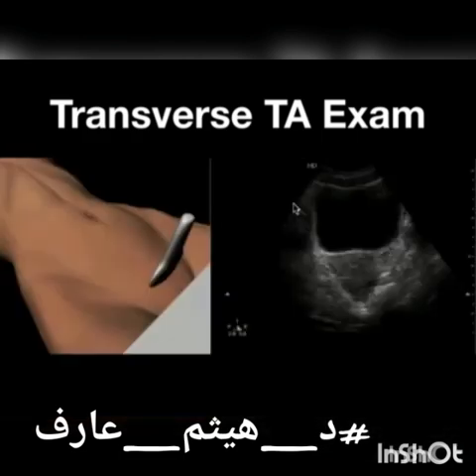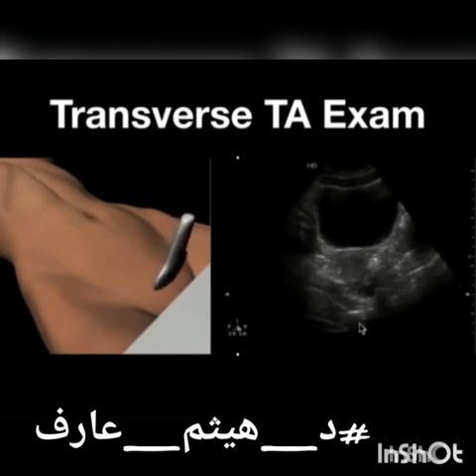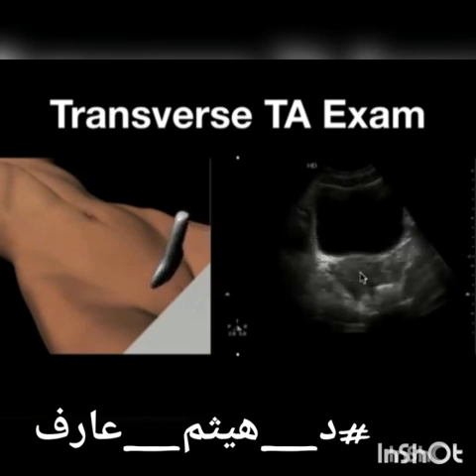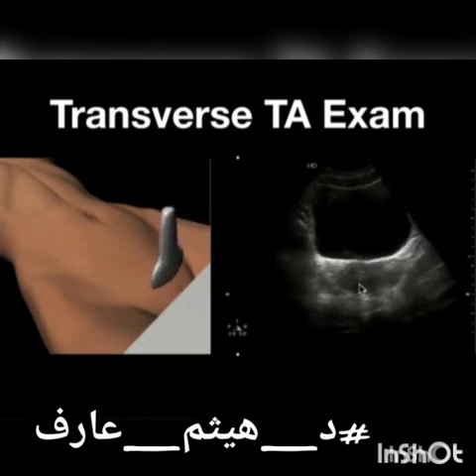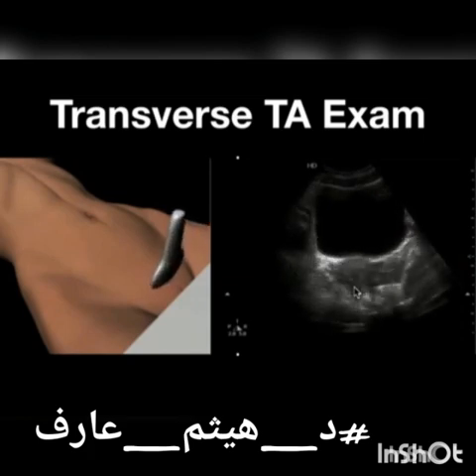Here we've got a transverse exam here. You can see that the transducer is going to be angled in a caudal and then cephalad direction, sweeping from the cervical region all the way up to the uterine fundus. This way you are able to fully assess the uterus.